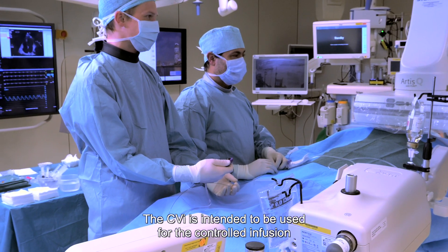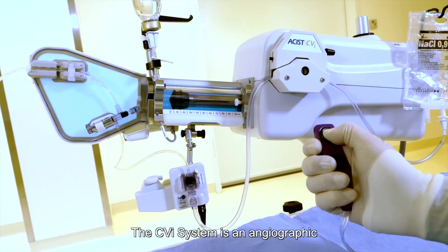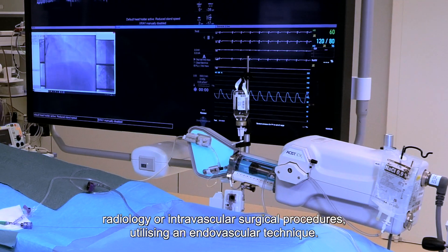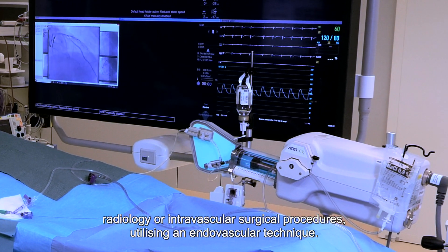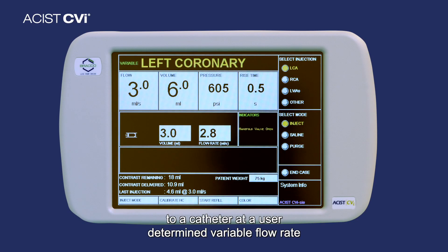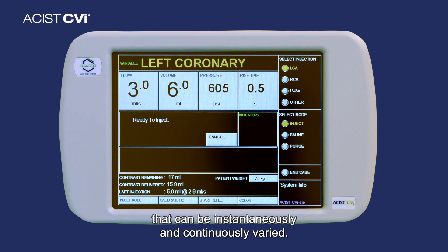The CVI is intended to be used for the controlled infusion of radiopaque contrast media for angiographic procedures. The CVI system is an angiographic injection system used in interventional cardiology, radiology, or intravascular surgical procedures utilizing an endovascular technique. The CVI system supplies radiopaque contrast media to a catheter at a user-determined variable flow rate that can be instantaneously and continuously varied.